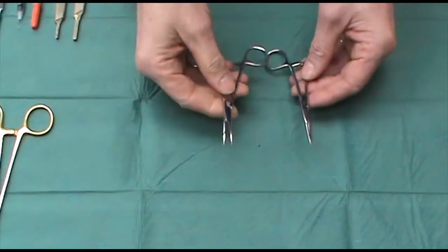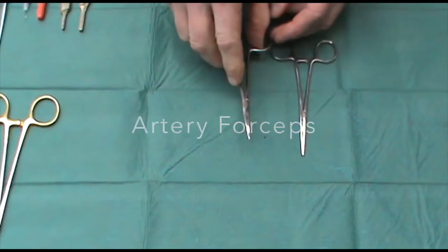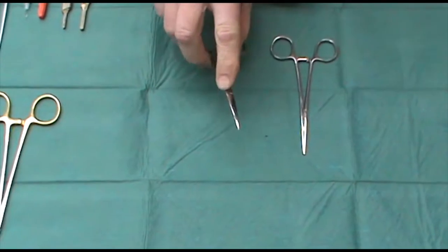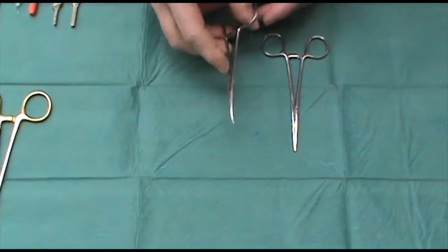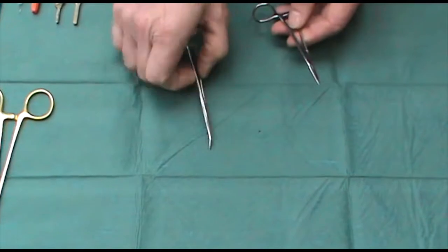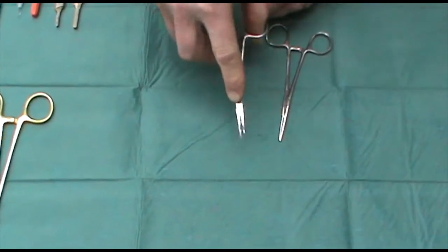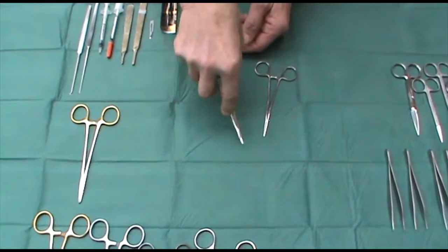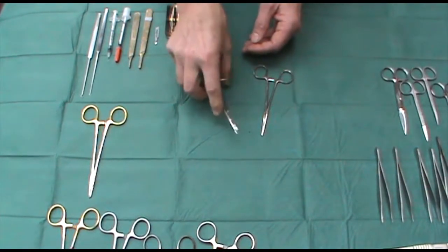I also have within my instrument sets a pair of artery or mosquito forceps. I do sometimes see people trying to use these to hold on to needles — they're not designed for that, although in an emergency they can be used. I like to have one straight pair and one curved pair. The curved pair is quite useful for gentle blunt dissection or releasing skin when you're trying to close wounds.